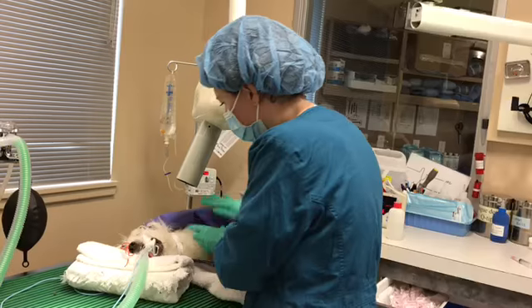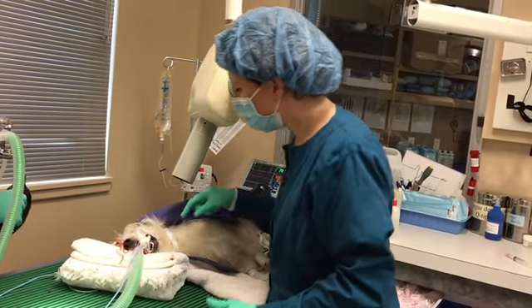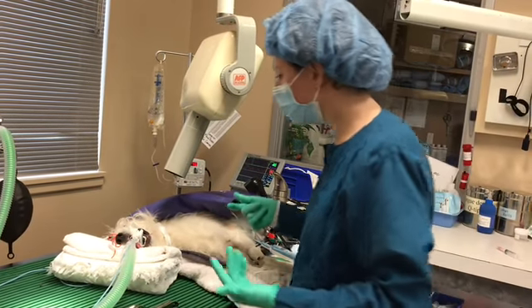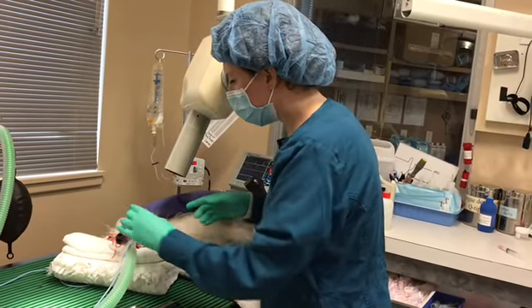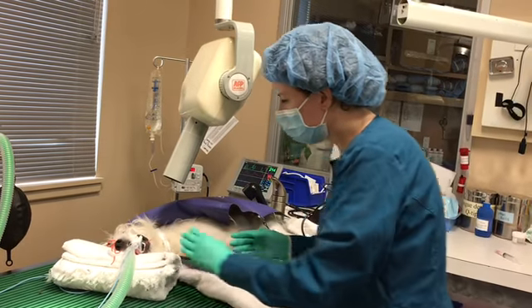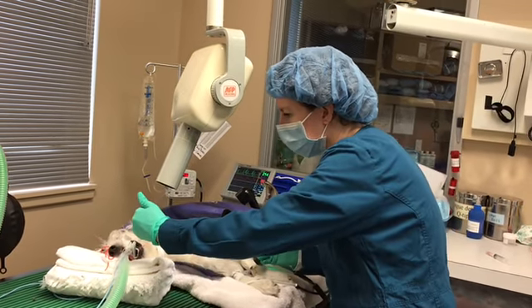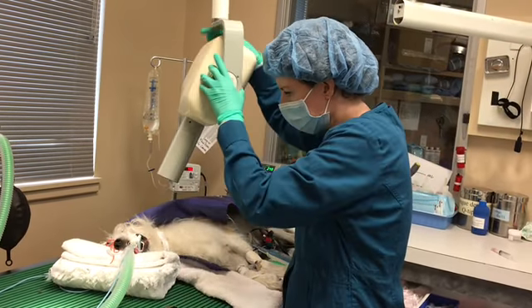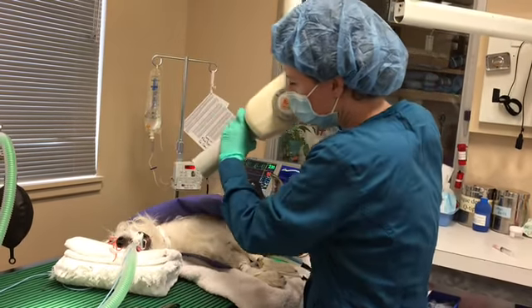Beautiful. Okay, for this we're going to do the premolars. We're using a bisecting angle technique. So I've got my sensor pulled up basically where the tongue is in the mouth, and we're going to come underneath here a little bit.